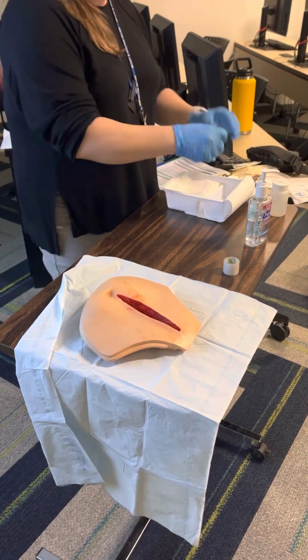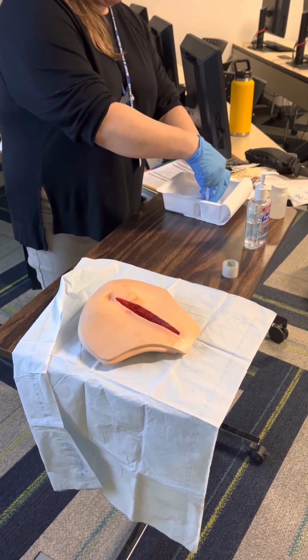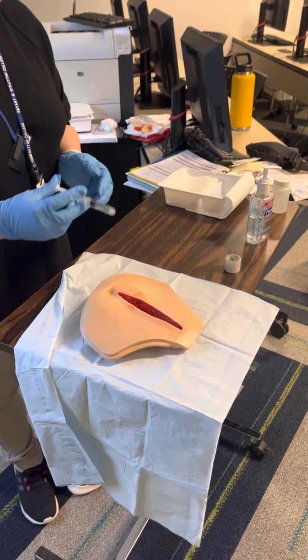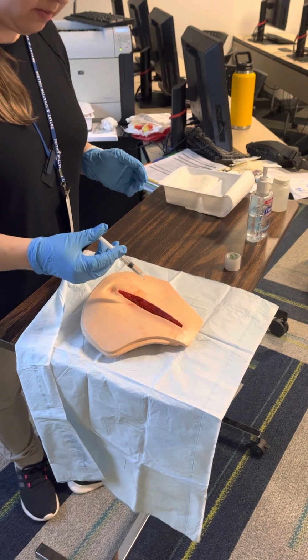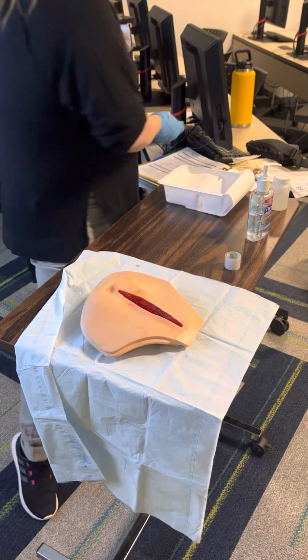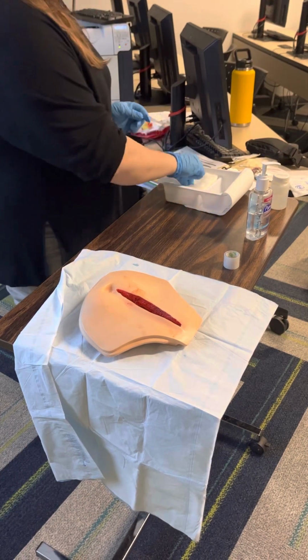I'm going to take my syringe. I'm going to put 2 to 3 mLs of saline in there, and I'm going to irrigate the wound. Now that this is dirty, I'm going to toss it to the side. I'm going to take a gauze.